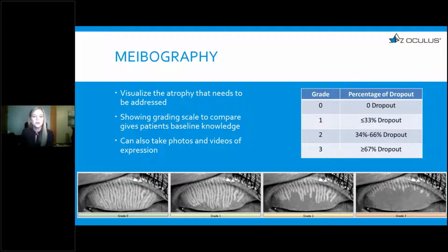So it really just buys in with the patient to say, wow, there really is a problem and I don't want to get worse. Okay, because most of the time when the patients come in, unfortunately, they can get worse. So say they're at a grade 1 or between a grade 1 and grade 2, I might say this isn't terrible and your symptoms are not terrible right now, but it can get worse. And unfortunately, if you come to me when it's all the way at the end, there's not a lot for me to work with and not a lot for me to help improve your symptoms. So it's also a great way to capture those patients.